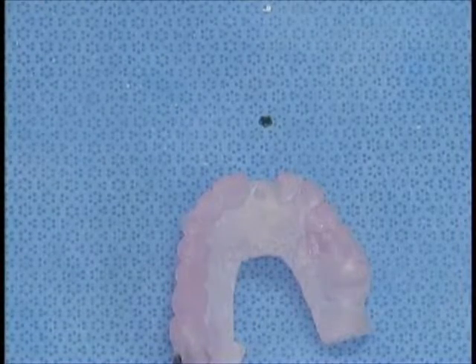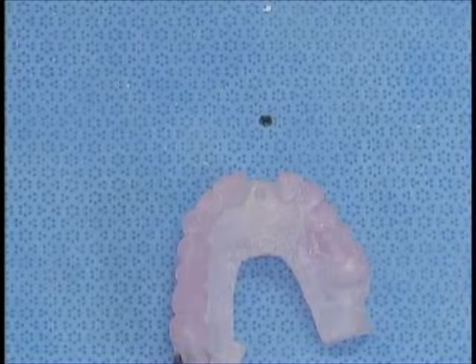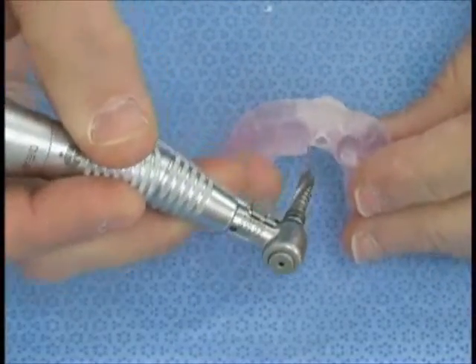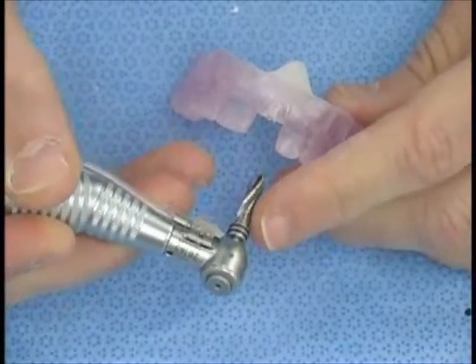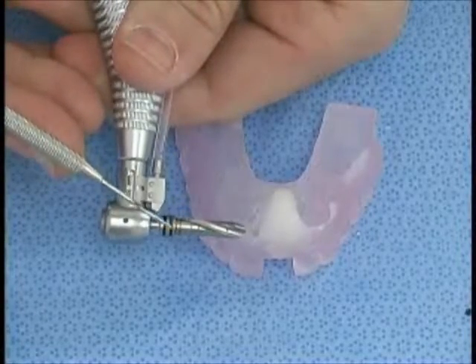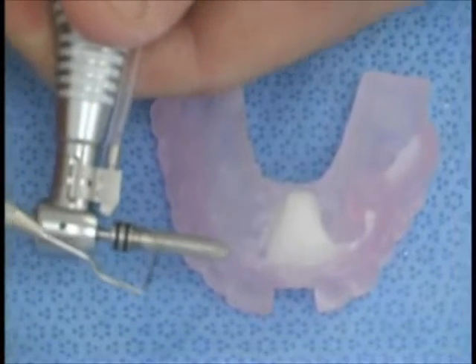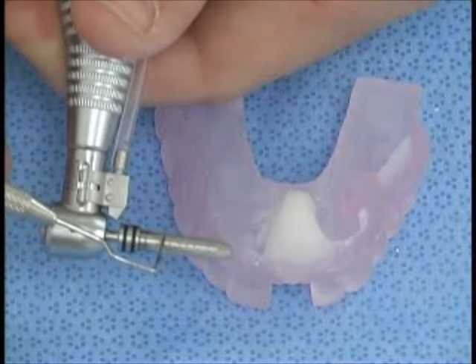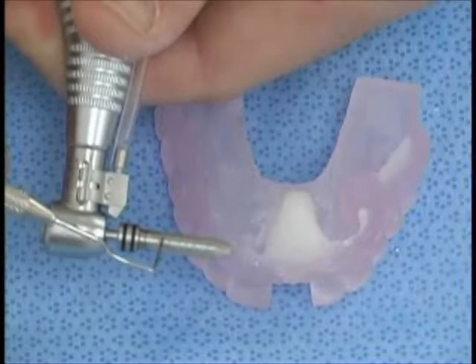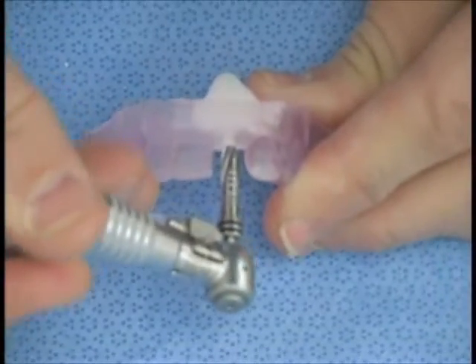For precise precision, once you get to this level, we can literally go and place it without the guide at this particular stage. So since the final drill in this case is a 4.5 anterior, you can see that there is 2 bands for anterior xive placement. So we're going to go to 11 millimeters plus 3 for the transgingival. We want to be around 14 millimeters below the gum line. We're going to use the adjacent teeth as a guide.